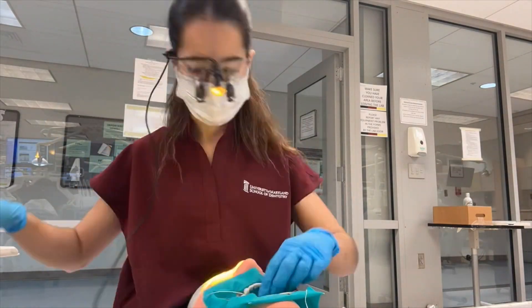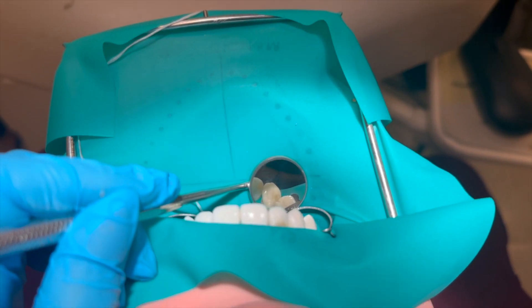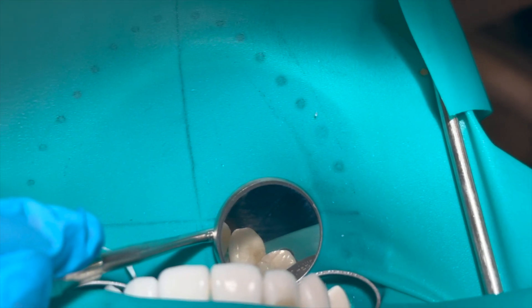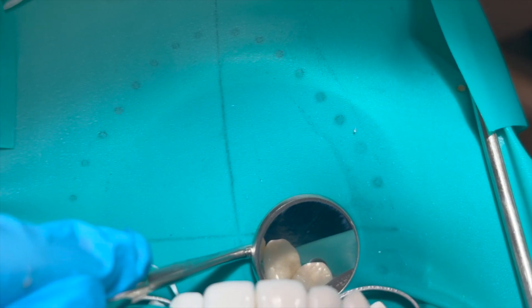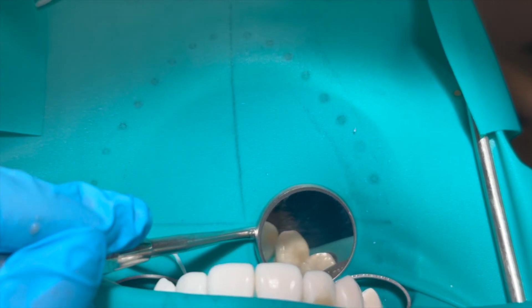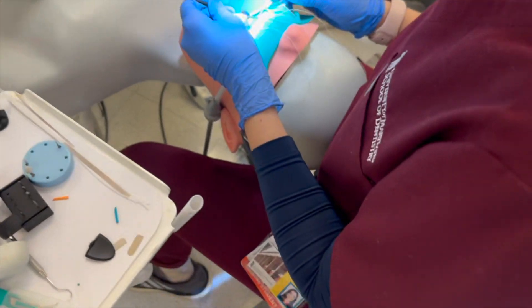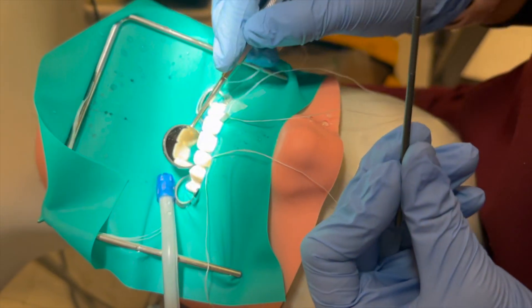This is my prep on number six — number six is a canine. I'm not done yet; I just put the material and cured it, but I still need to polish it and make it smooth. But this is how it's looking so far — I know it's a little hard to see.